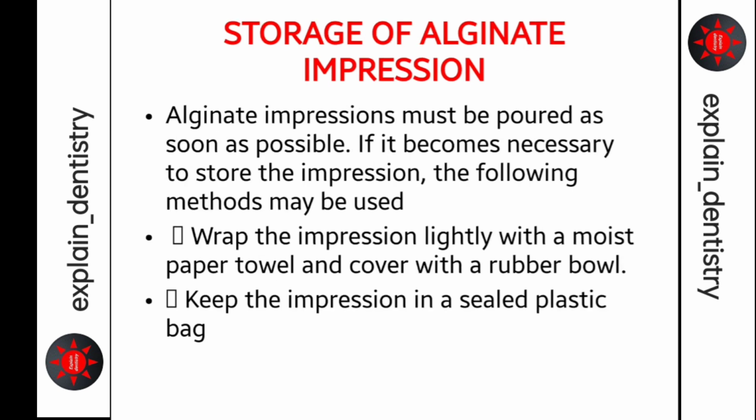Storage of alginate impression. If we need to store the alginate impression for more than 15 minutes, we should use these techniques: wrap the impression lightly with a moist paper towel and cover with a rubber bowl. Keep the impression in a sealed plastic bag.